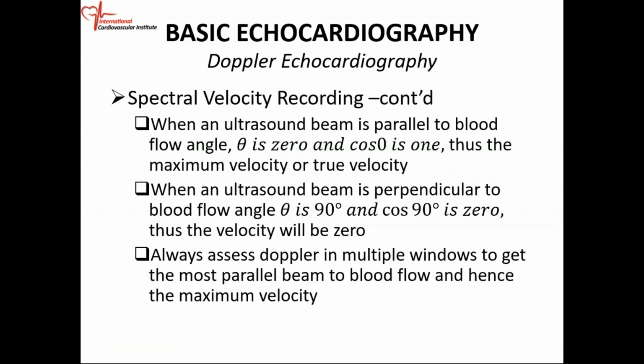Doppler is limited by the angle, the angle theta. That is the limitation of Doppler. You always try to get the ultrasound beam as parallel to flow as possible. You want to get this angle theta close to 0.